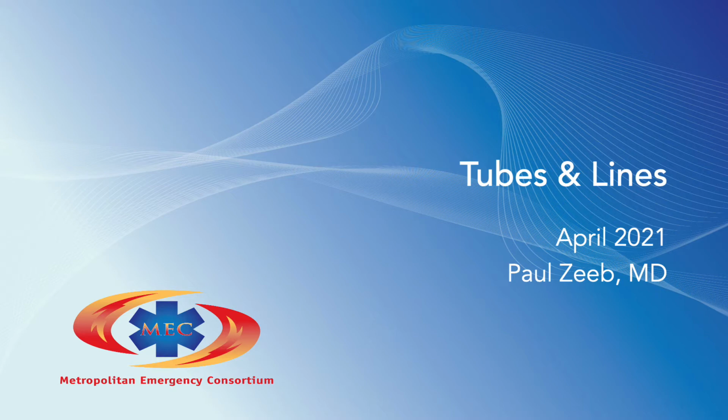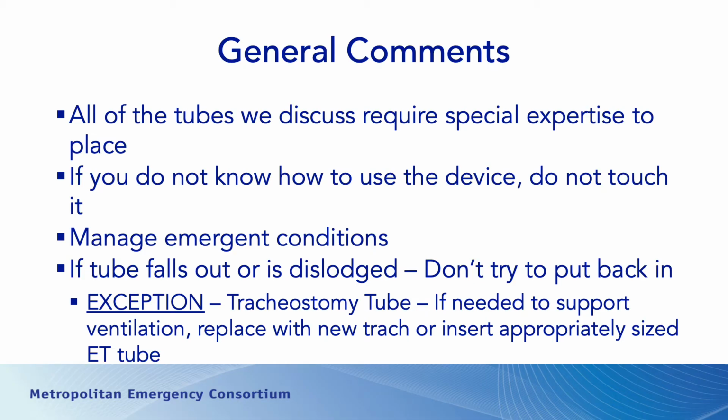And I'm doing this conversation today based on some questions I received recently from some of our providers. So just some general comments as we start. All the tubes, all the lines that we are going to discuss today require special expertise for placement. So these are things that typically we would not expect you to place in the field, but we expect you to have some understanding of the devices and how to problem solve if there are issues.